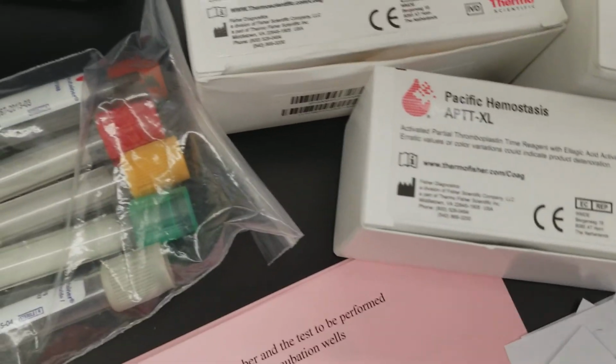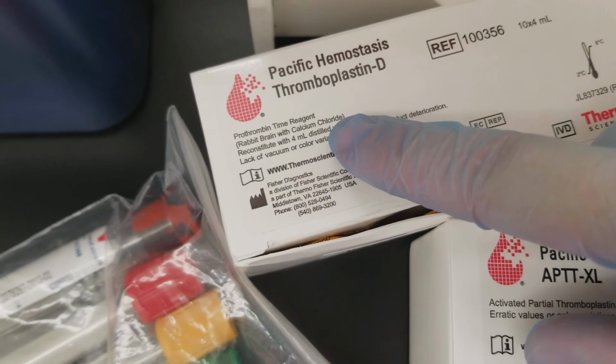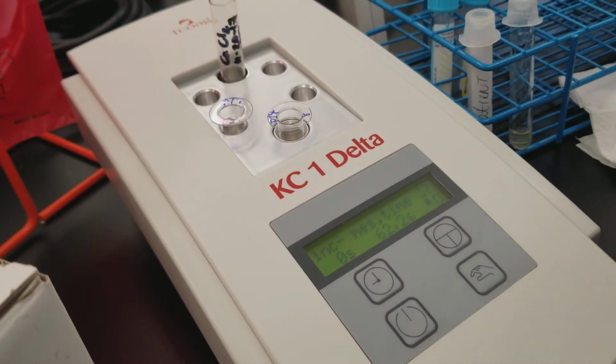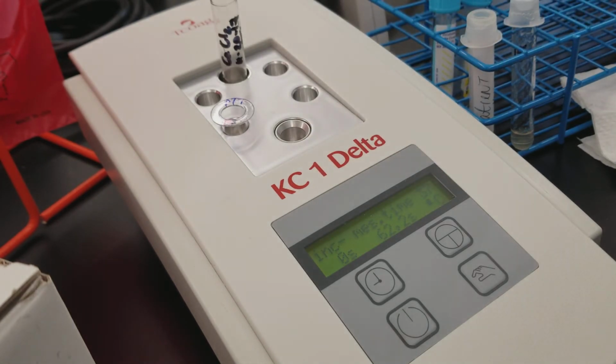It already has the calcium in it. So if you see here, it says it already has calcium chloride in it. So in that case, when you hit that clock face and you're going to add your reagent, in that test, it would be the PT reagent. Okay, so let's do another PTT, the one on the other patient.